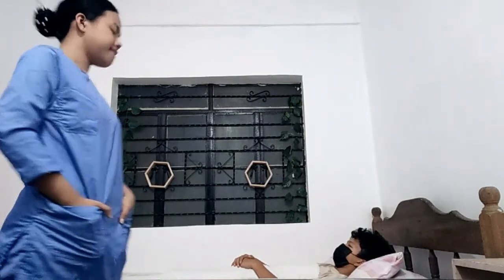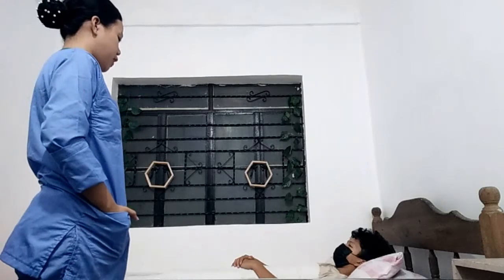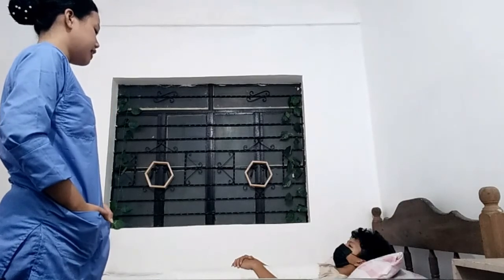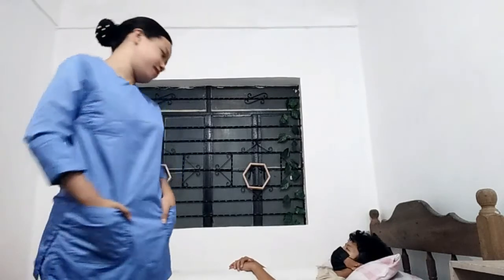Ramos. Yes. Next is assess patient's level of pain. How do you feel right now? Do you have any pain? From the scale of 0 as the lowest in pain scale and 10 as the highest. 5. Okay. Third is review medical record for healthcare provider's prescription for irrigation of open wound and type of solution.